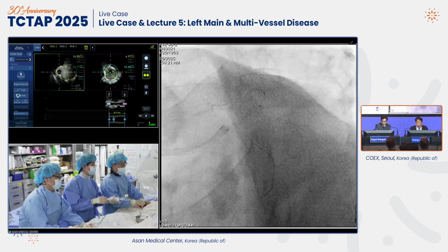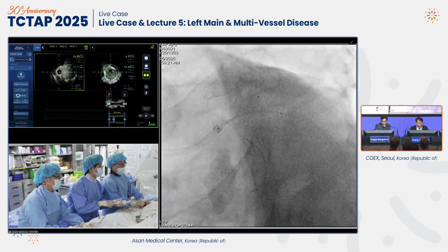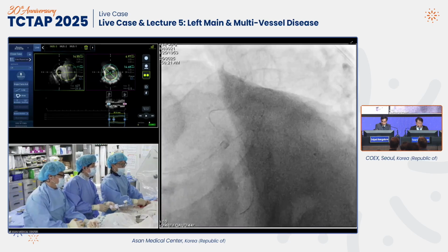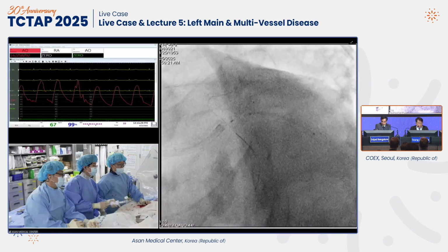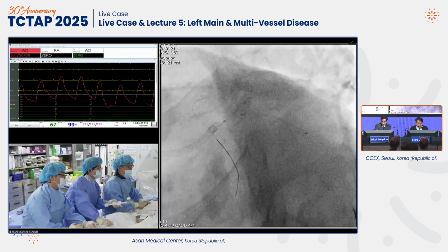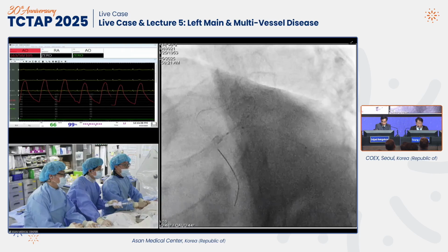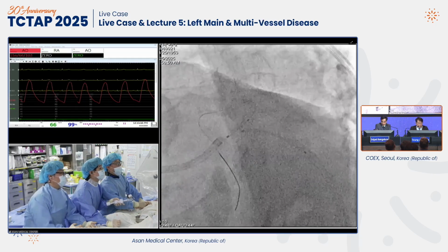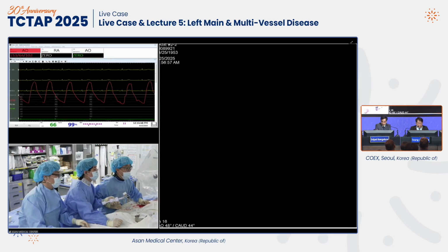Okay. So this is a 3.5 synergy stent. Okay, fully covered, and then I'm going to pull back the left main, the 4.0. Okay, so I will do reverse crush and slightly pull back over here. Okay, so I'm going to check the stent booster to overlap the distal part. I think the distal part absolutely overlaps well.